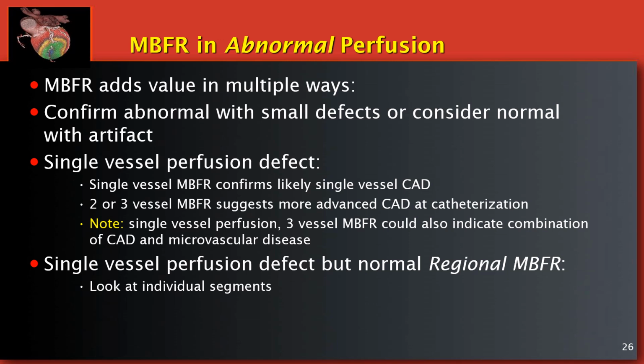And if there's a single vessel perfusion defect but normal regional blood flow, that's where you need to look at the individual segments, or the physician does, to determine if it's single vessel disease or not.